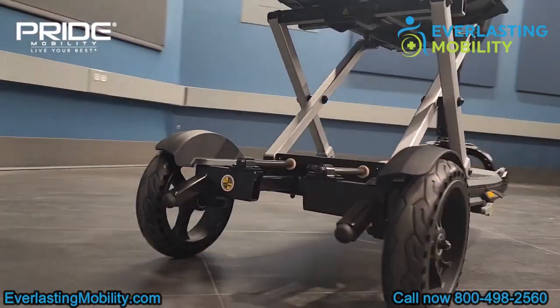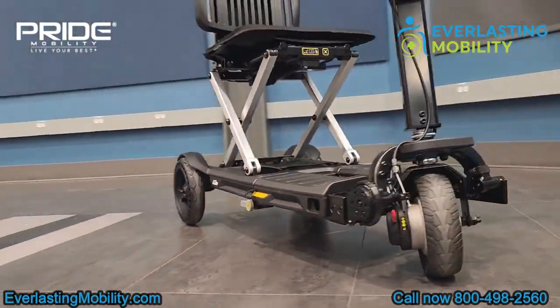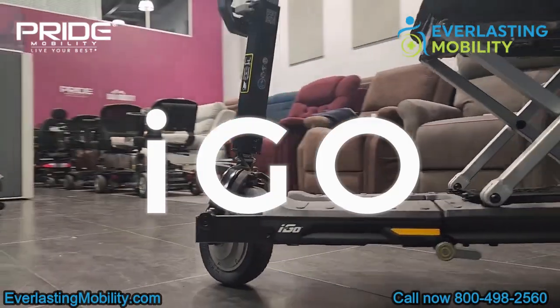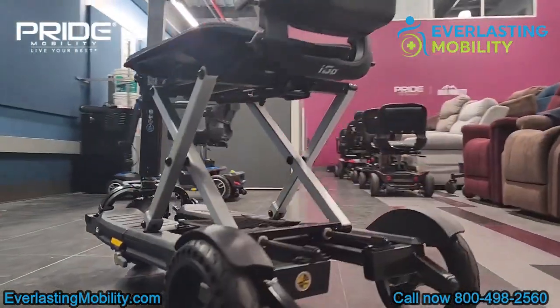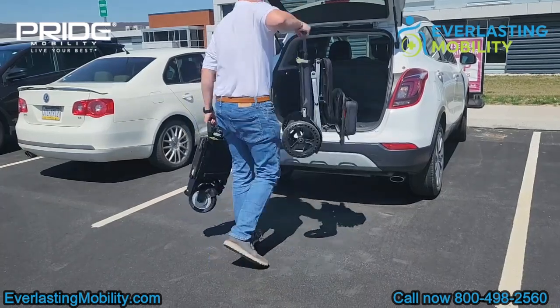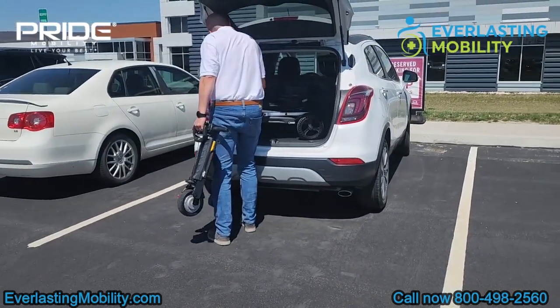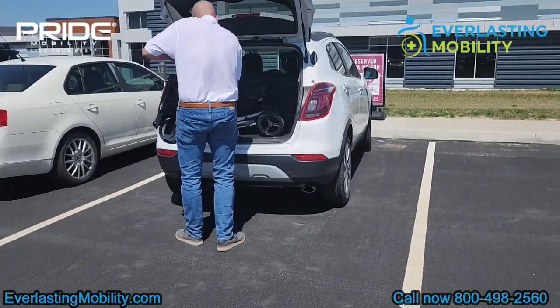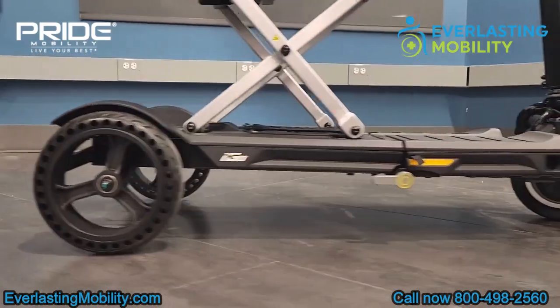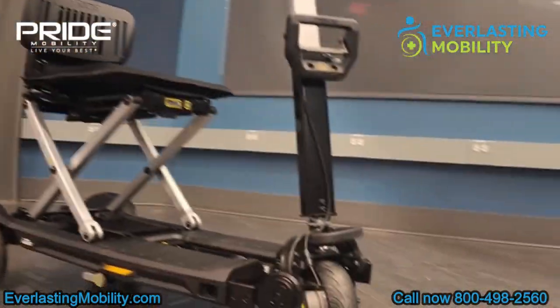In this video, we're going to talk about Pride Mobility's newest folding mobility scooter, the Aigo. One thing that's unique about this scooter is you can fold it up into one piece, but if that's too heavy for you, you can actually break it into two more lightweight pieces. It's offered in four colors: white, black, iceberg blue, or sugar plum. It's airline approved, has a small footprint once it's folded, and it's a really cool scooter. So we're going to show you some more features about the Aigo.